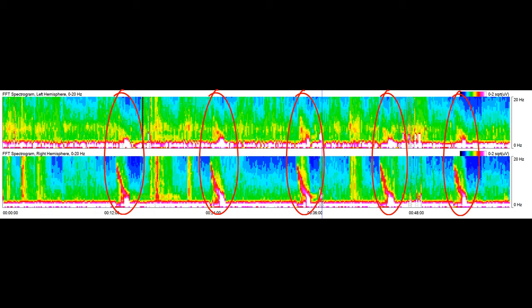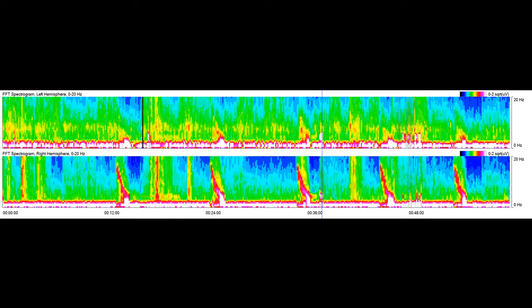First, what does the name FFT spectrogram mean? The FFT portion of the name abbreviates Fast Fourier Transform, which is the computationally efficient algorithm that splits the raw EEG signal into a series of sine waves that, when added together, approximate the original EEG trace.